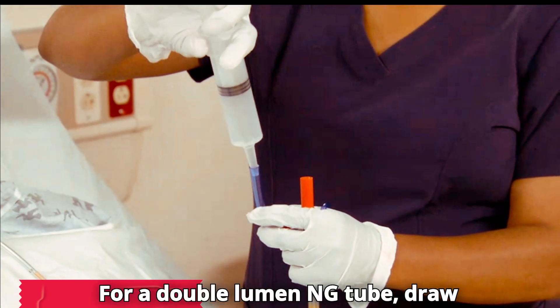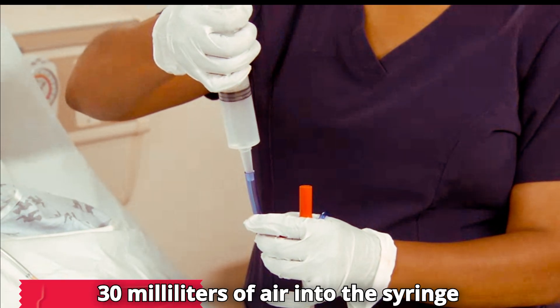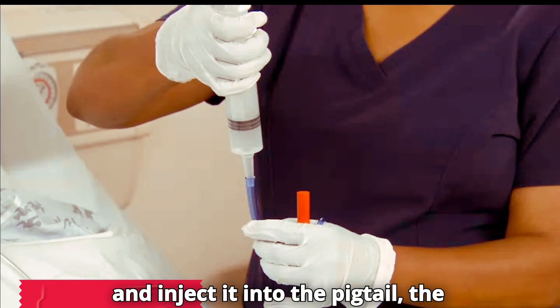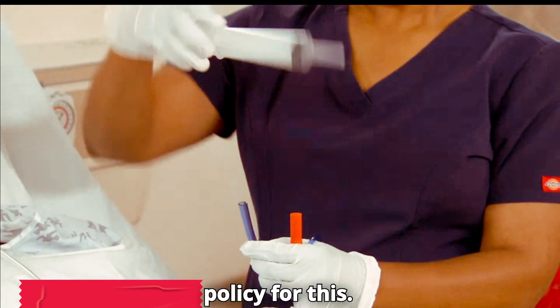For a double lumen NG tube, draw 30 milliliters of air into the syringe and inject it into the pigtail, the smaller bore tube. Follow agency policy for this.